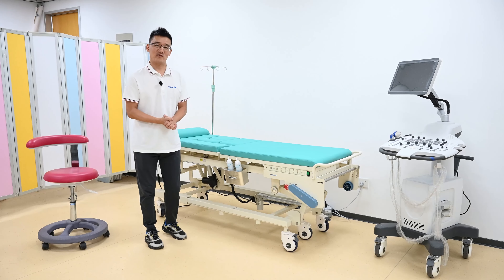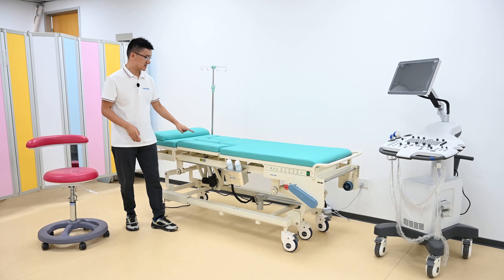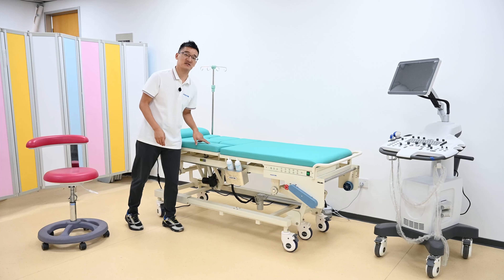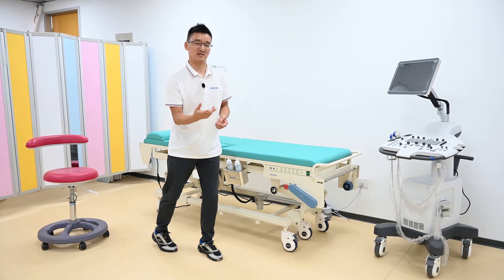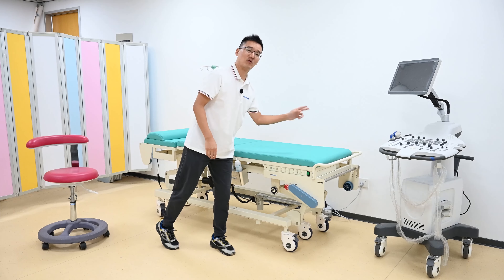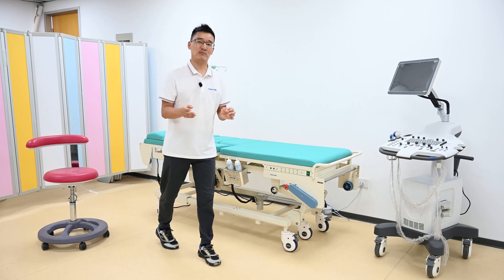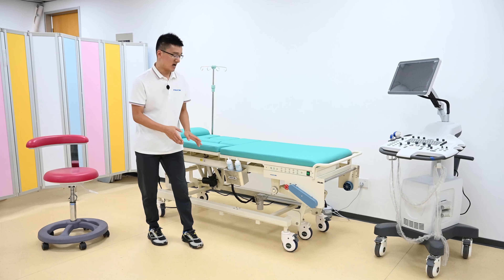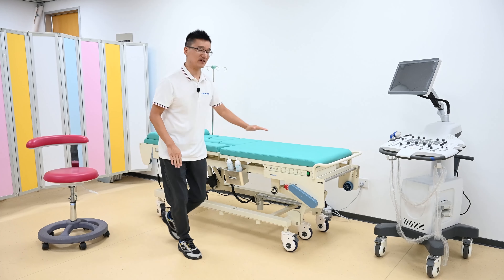Besides the general functions for this table, we have four unique design functions. First, you may note the platform top is divided with many functions. We have a very unique cardiac diagnosis position for the doctor. Second is the automatic paper rolling function. Third is the liquid gel heater — after we warm it, the patient has a good feeling. And the fourth is the horizontal sliding function.